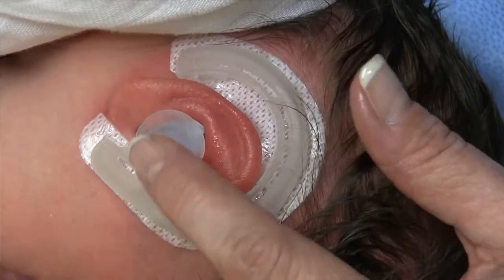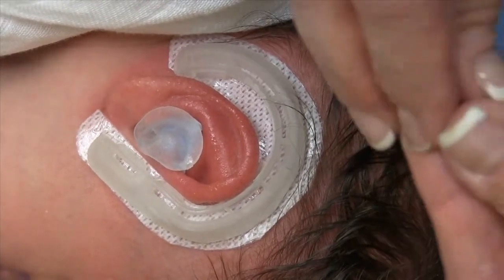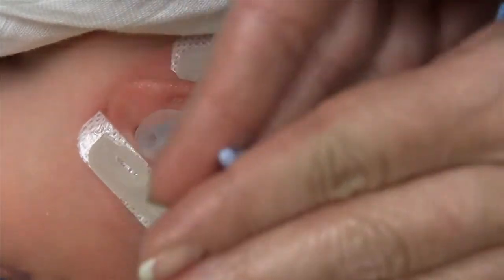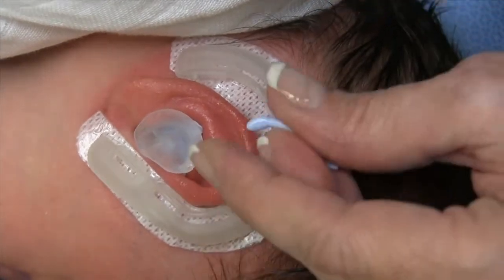It fits in there very nicely like that — it's already starting to set up. Then we'll take another piece and make a small prosthesis that's going to fit inside the helical rim.